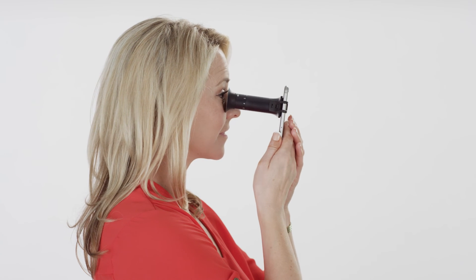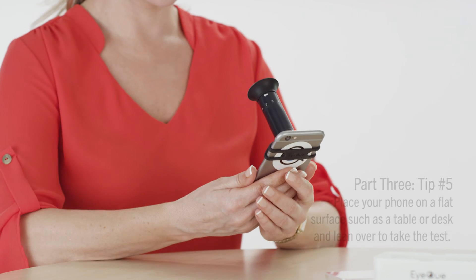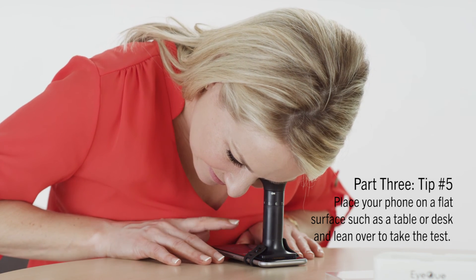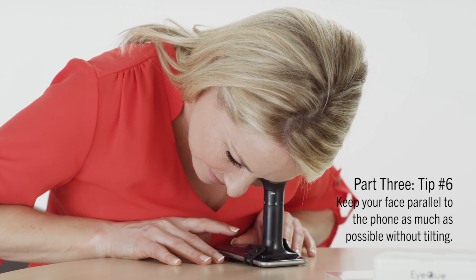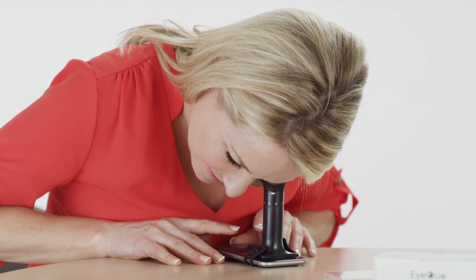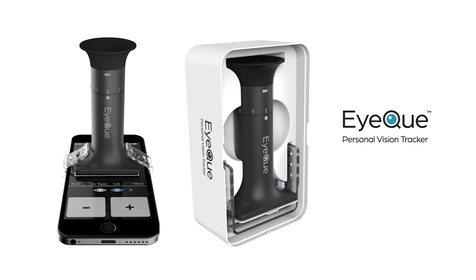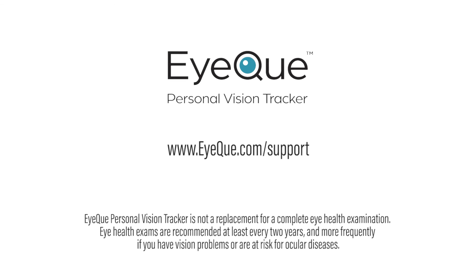An option for folks who might find it difficult to navigate the test screen while holding their smartphone straight up: simply find a flat surface like a table or desk, set your smartphone on it, and just lean over to look into the Miniscope and take your vision test. Keep your face as parallel to the phone as possible. We don't recommend this pose for those under 45 years of age due to accommodation. At EyeQue, we're dedicated to providing a convenient and fun way to track your vision. We hope these tips and suggestions will help make your test results even more accurate and insightful. Thank you.